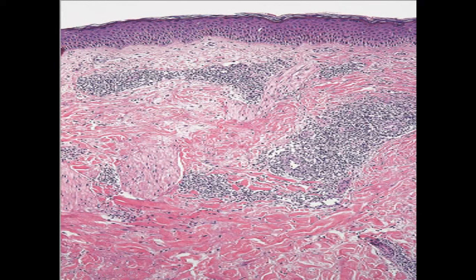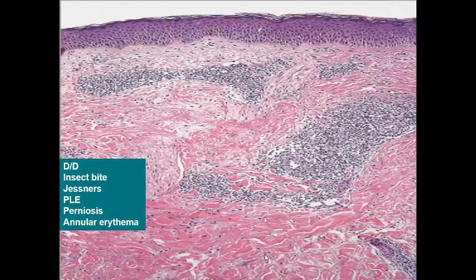This image shows sleeve-like perivascular lymphohistiocytic infiltrate. With a normal epidermis, no basal cell vacuolar degeneration, no granulomas, and no other cells, the only finding is superficial and deep perivascular lymphocytic infiltrate. Differential diagnoses include insect bite reaction (usually associated with eosinophils), Jessner's lymphocytic infiltrate, polymorphic light eruption, perniosis, and various annular erythemas.